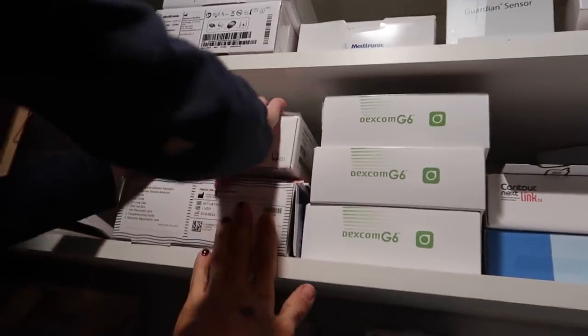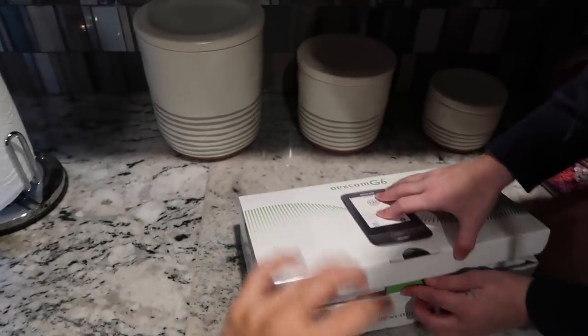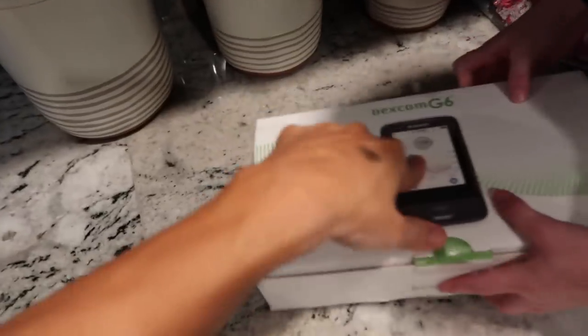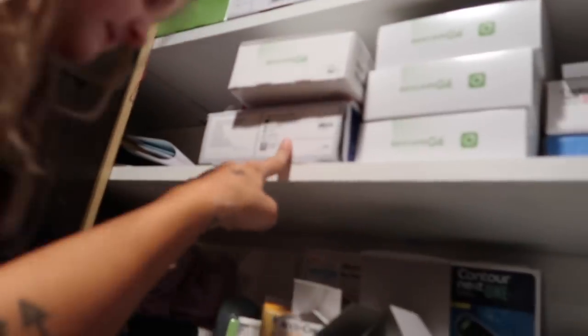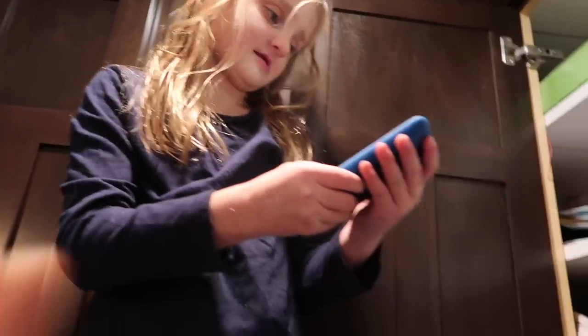So then we'll go here — this is her Dexcom G6. This is just the box that held her monitor. We keep all those. Here's the monitor — it used to be pink, but I turned it to blue because Grayson wanted it. And that would check her blood too, but she uses her iPod.